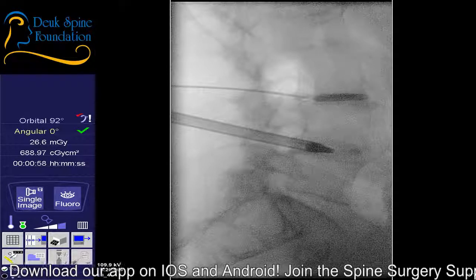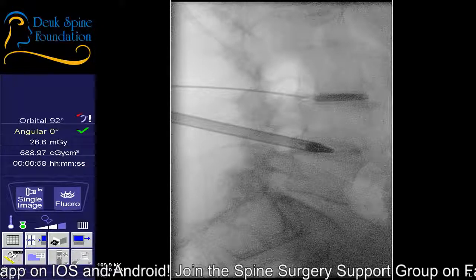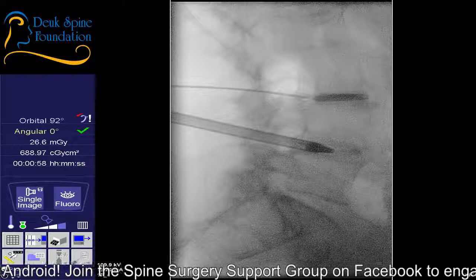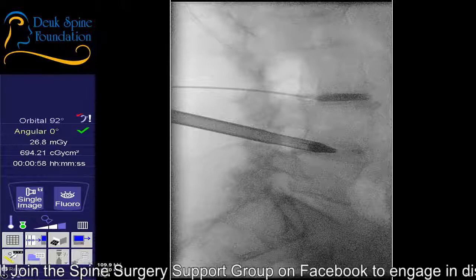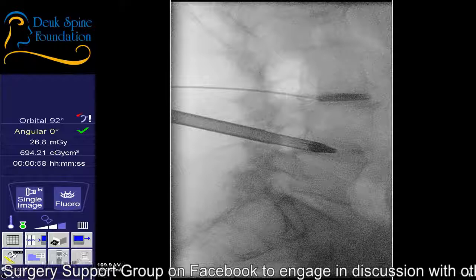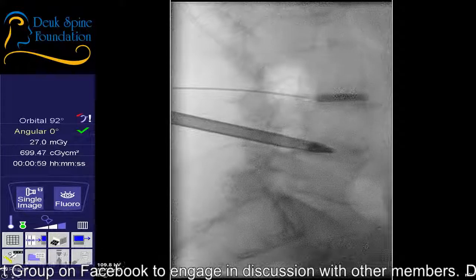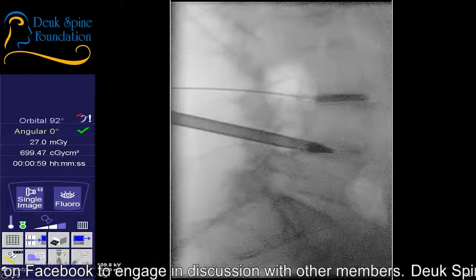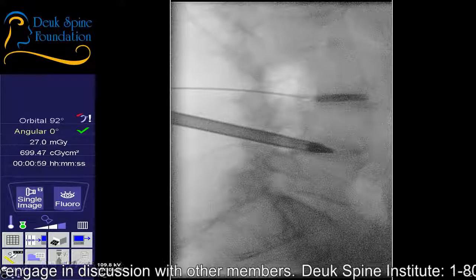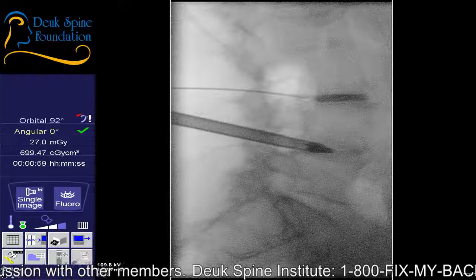So having experienced hands that I can feel. It looks like I'm making a barbaric move, but I can actually feel every millimeter that that dilator moves through her body. I can feel the bones separating. I can feel the disc giving way. I can feel all of it happening. I can see it happening in my mind too, and I see it on the x-ray to affirm what I'm feeling. That's what a good surgeon does, okay? And it doesn't matter if you're a neurosurgeon or an orthopedic surgeon. It matters if you pay attention and you can feel that change.